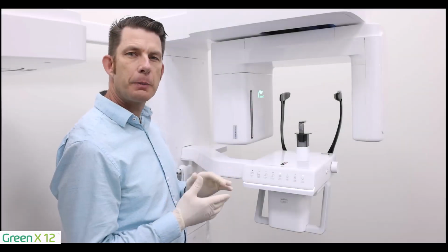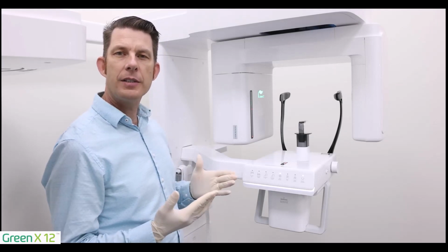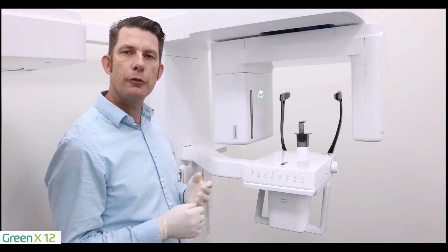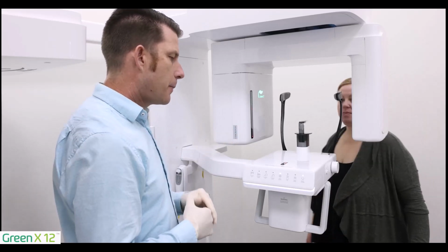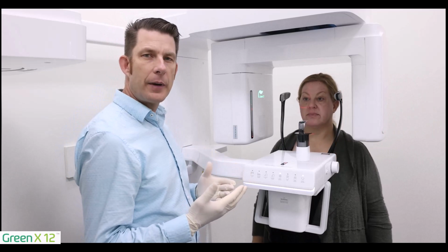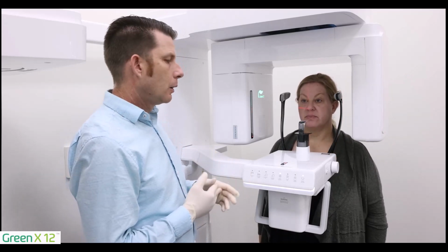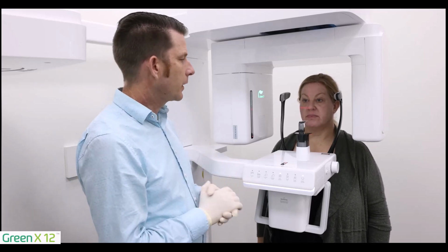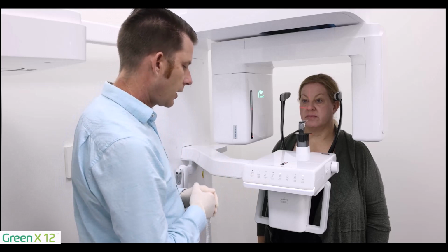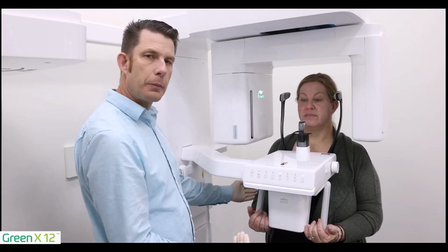The Vatech Green X platform also includes 2-dimensional extraoral bite wings, and let's look at patient positioning for that now. I'm going to go and bring my patient back. And patient positioning for extraoral bite wings is very similar to taking your panoramic image. Really the difference is the location of the canine beam. So we're going to go through our patient positioning protocol, starting with our hands and our feet. So hands, palms facing up, feet shoulder length apart.